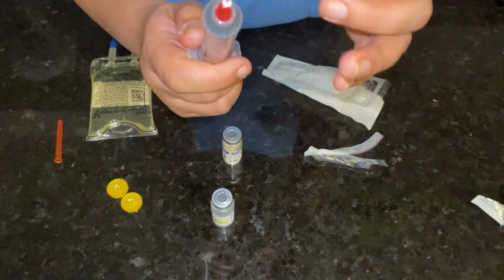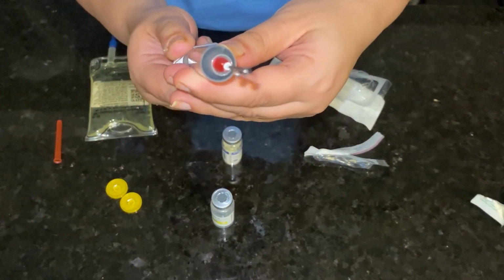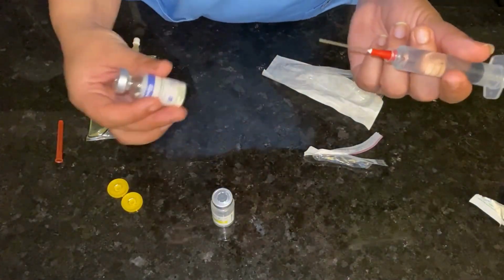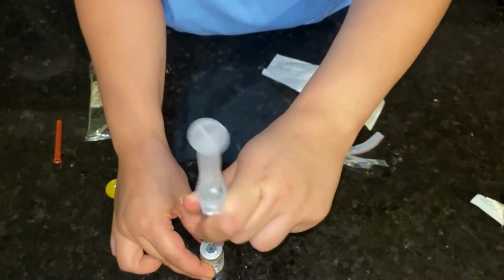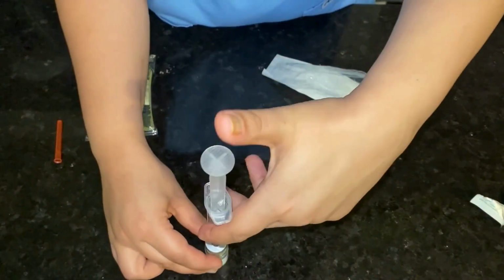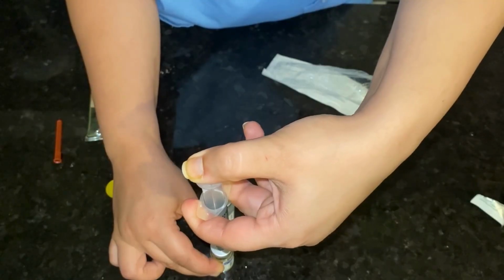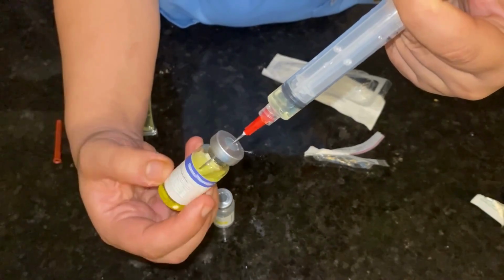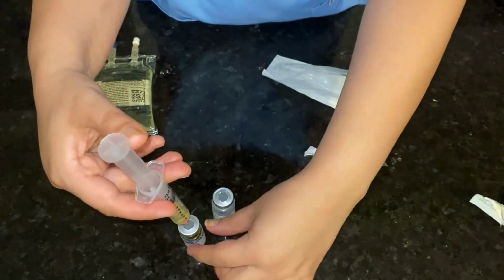It has a couple of air bubbles that I try to empty. Perfect. See, 10 ml. So I will add this 10 ml to my powder. As you see, it was completely added because of the negative pressure.